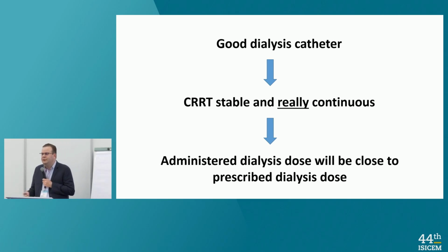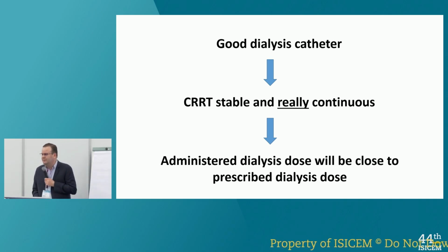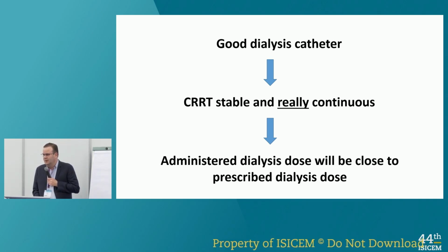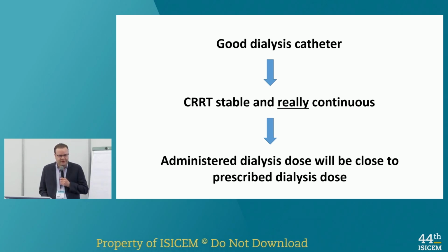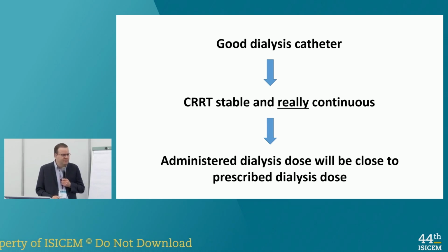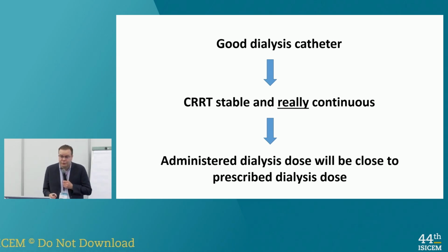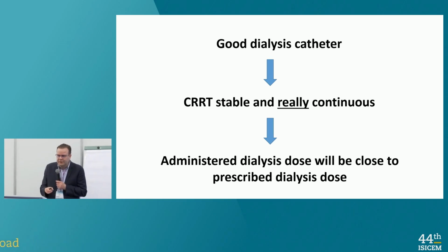Because you can claim that you do CRT in your unit, but if every 15 or 30 minutes there is an alarm and your machine stops, this is not continuous renal replacement therapy, right? So it's very important to understand that if you manage your catheters correctly, then you're going to do really continuous renal replacement therapy. And then the gap between the administered dialysis dose and the prescribed dose will be very much reduced.